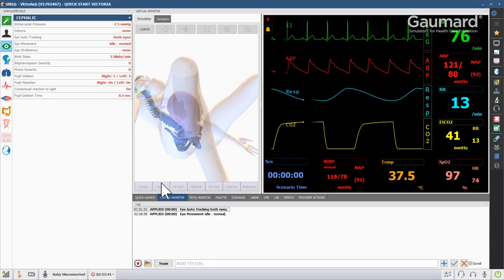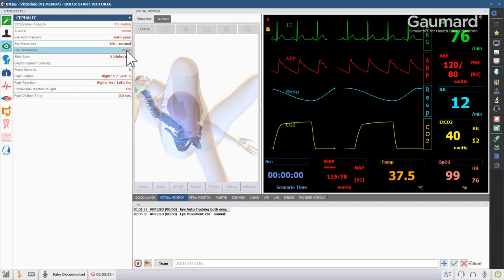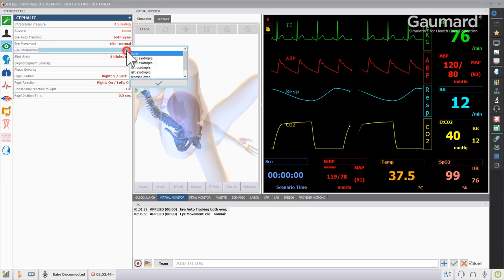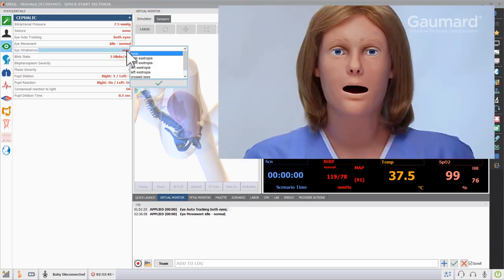Click the value next to eye strabismus to apply a condition that will display with other movements or during tracking.